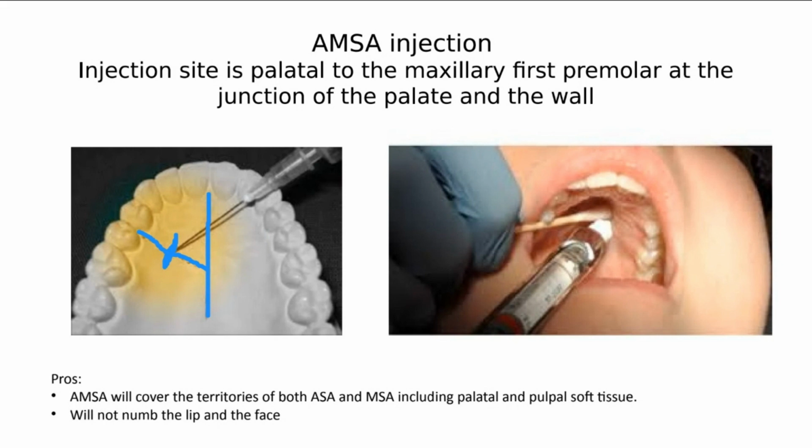yes, it does hurt more. That's true. Palate always hurts more. So again, you will learn more about the clinical aspect of that. It does hurt more. You should put some local anesthesia first, and so on. But again, it's one injection, and it gives you both of those if you're working on multiple teeth or something like that. So it's an alternative, and again, they will give you more idea in the clinic.